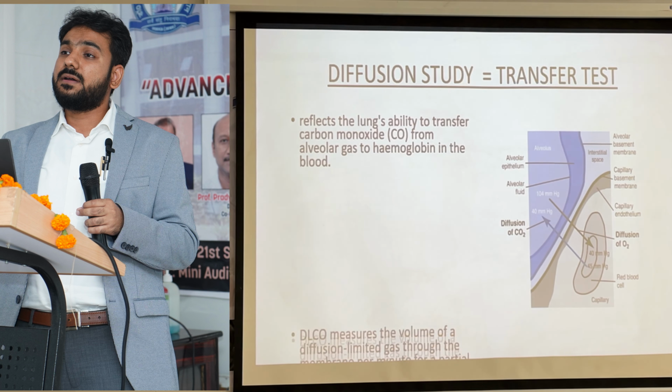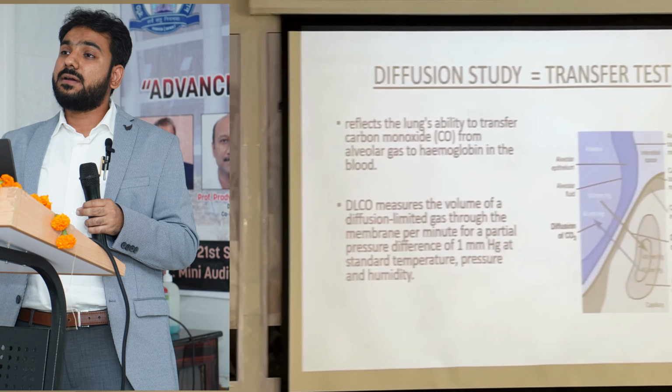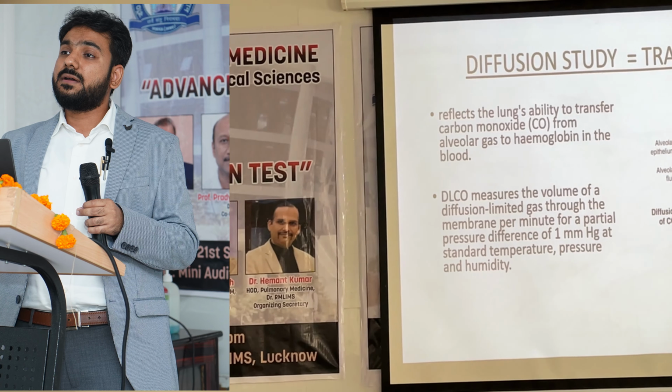What is the DLCO test? It reflects the lungs' ability to transfer carbon monoxide from alveolar gas down to the hemoglobin, and it binds to the hemoglobin. It measures the volume of diffusion limited gas, the gas has to be diffusion limited, that is passing through this membrane per minute at a partial pressure difference of 1 mmHg. This is what DLCO basically is.